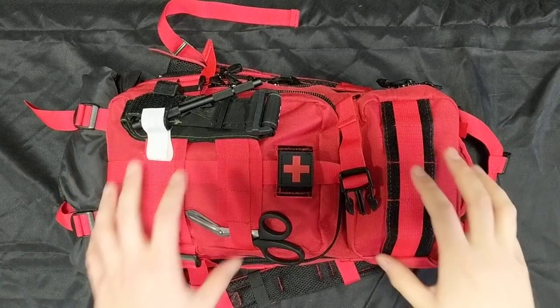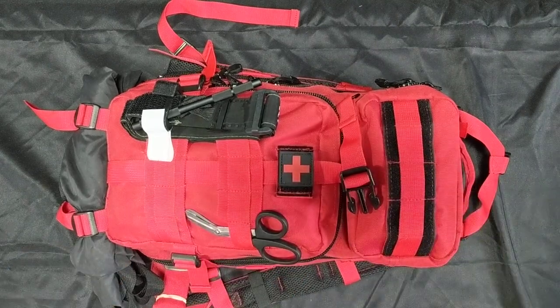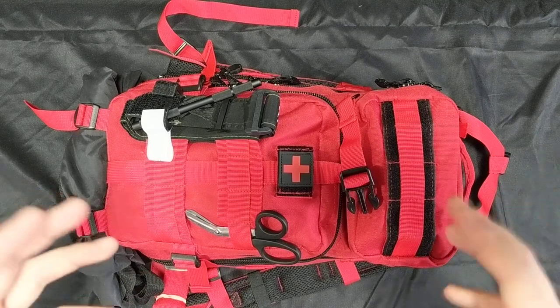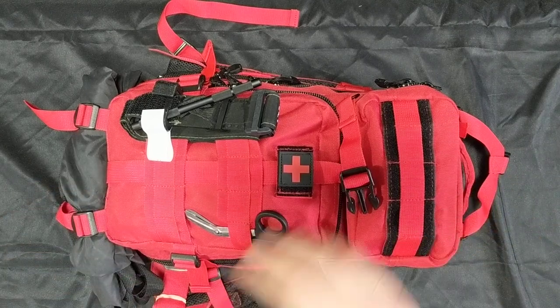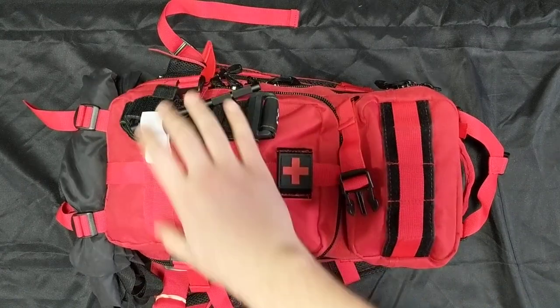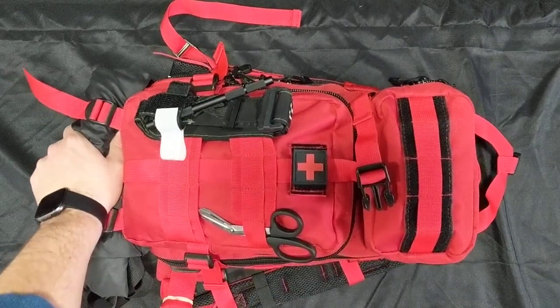This is the First Responder Jump Bag — a high-quality 600 denier bag with tons of MOLLE, all organized. It has everything you need to treat patients as a first responder, emergency medical responder, or EMT basic. Right off the bat you've got trauma shears and tourniquets — your quick-need items — and a stretcher right down here rated at 700 pounds.